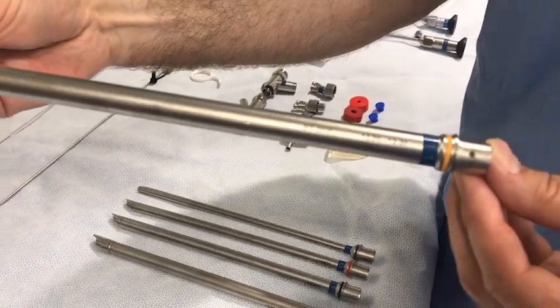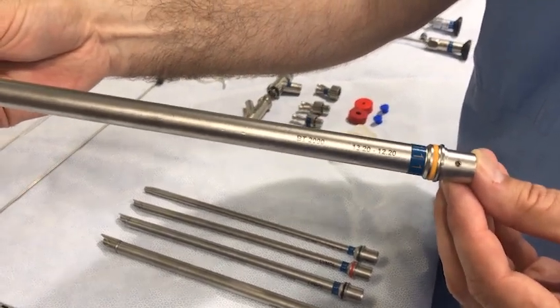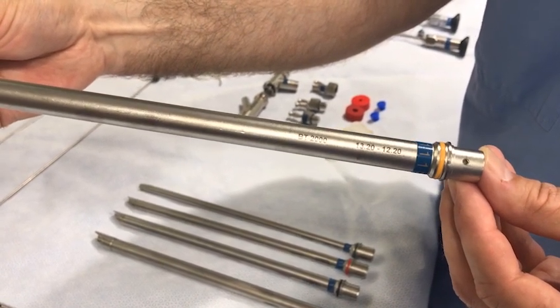The size of the rigid Bronchoscope can be found on the proximal end of the scope. This is the largest Bronchoscope with an internal to external diameter of 12 to 13 millimeters and has a yellow stripe at the proximal end of the scope.